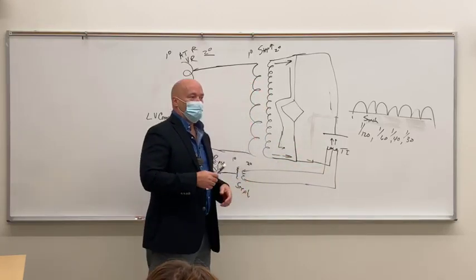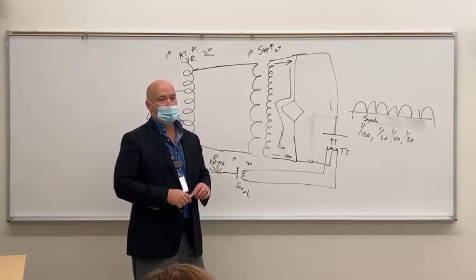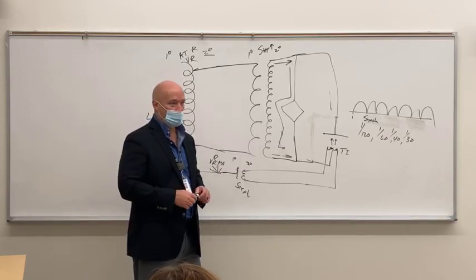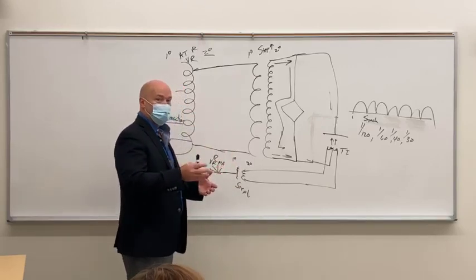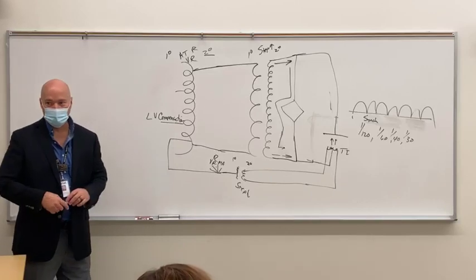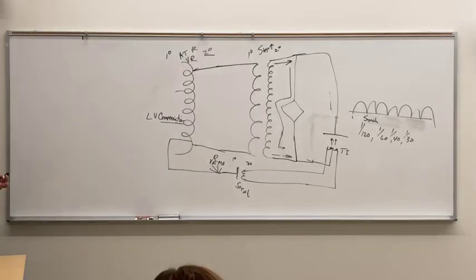But realistically, if you're phototiming and you adjust the kVp, it's not going to have any effect on the exposure to the image receptor. It might have an effect on the exposure to the patient, but to the image receptor, it's not going to have any kind of effect at all. You increase your kVp, it shortens exposure time. You decrease your kVp, and it increases exposure time.